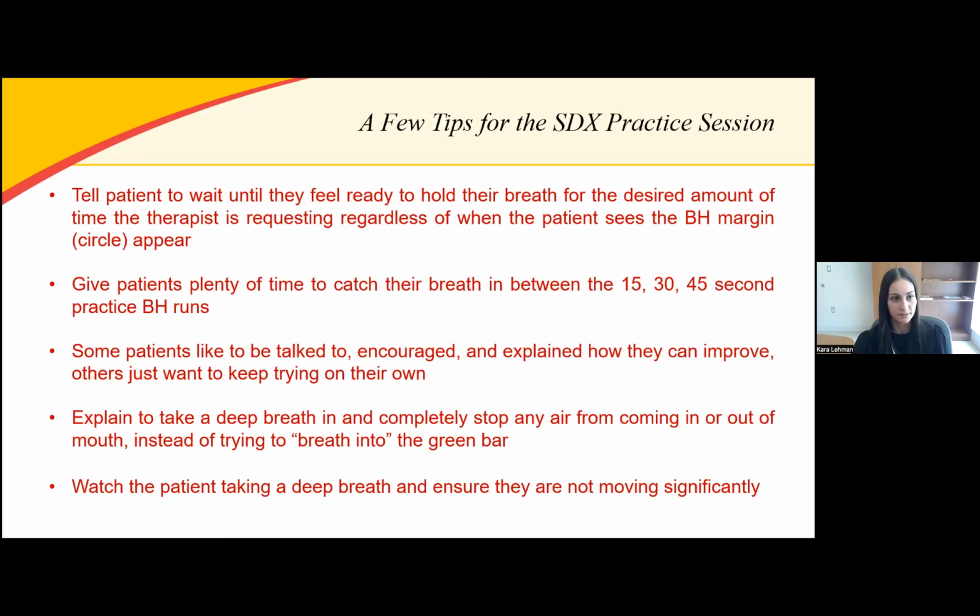So just a few tips that I've compiled together from the SDX practice session, just to dive a little bit deeper into some of the things I just talked about. Make sure you tell a patient to hold until they feel ready to hold their breath for the desired amount of time that you're requesting, regardless of when they see that margin appear.